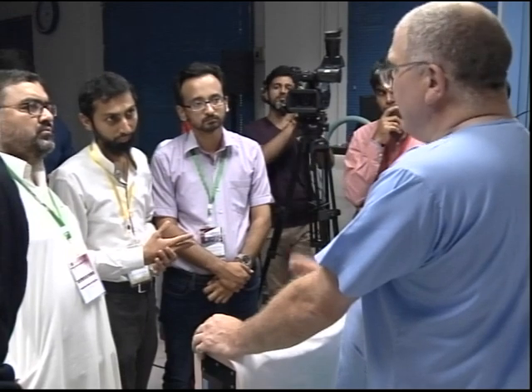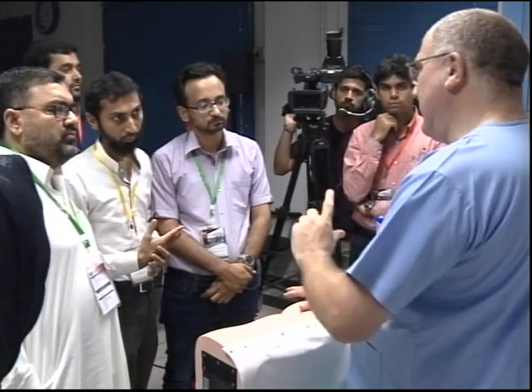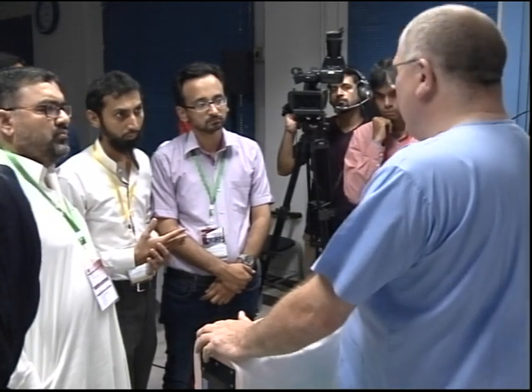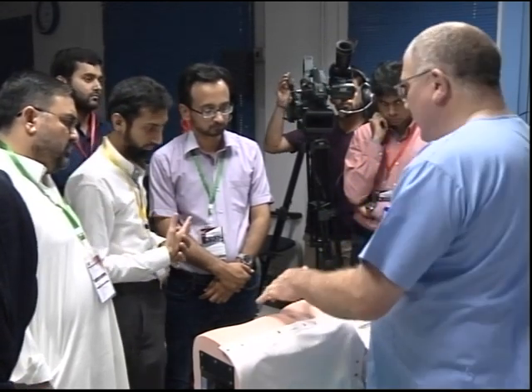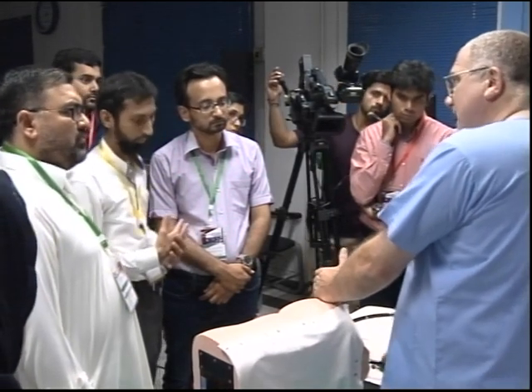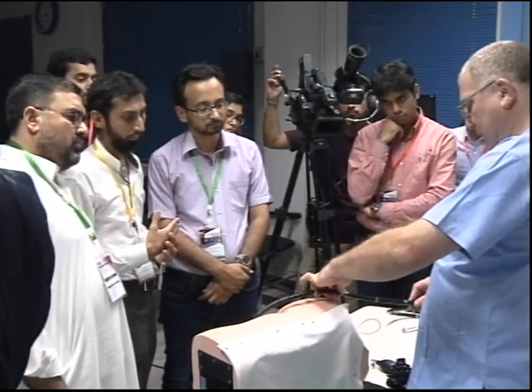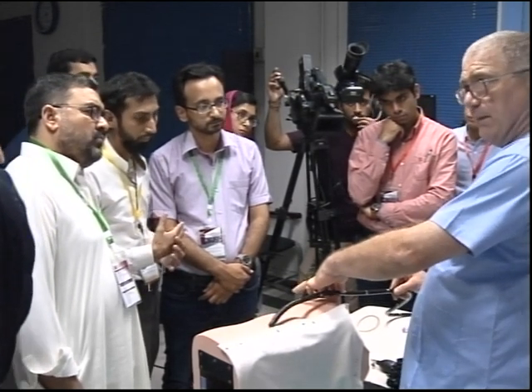Or in real life here, if you see me scope, I will proceed as much as I can in the left lateral. And particularly if I've got ladies, and ever since coming here, I will make sure they're well covered. The other thing is in this country, compared to the UK, in the UK, ladies or gents, I will reveal this amount. Here, I won't. I'll scope with the blanket here, and my hand here. So with that in mind, you've got that amount of scope between you and the anus. So it does change how you scope a little bit.